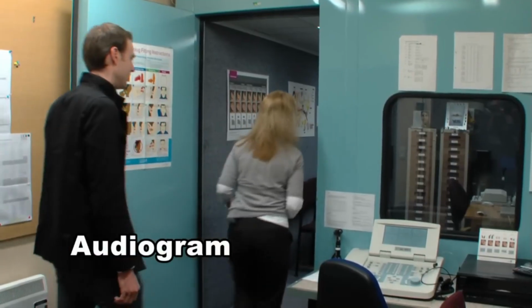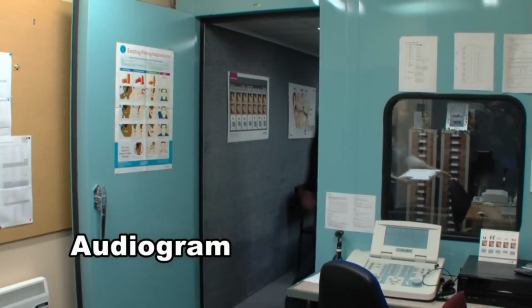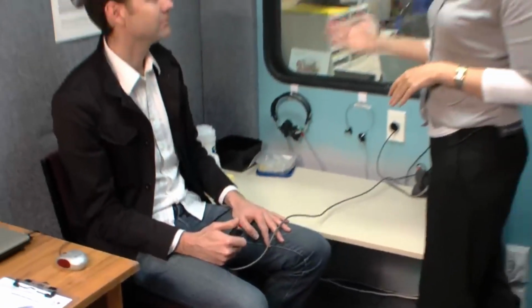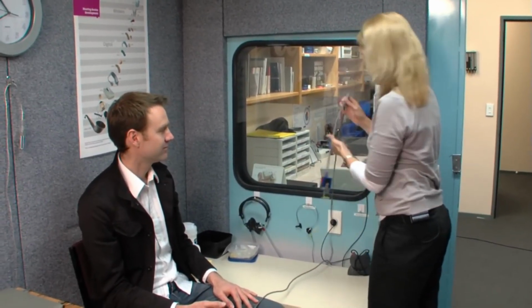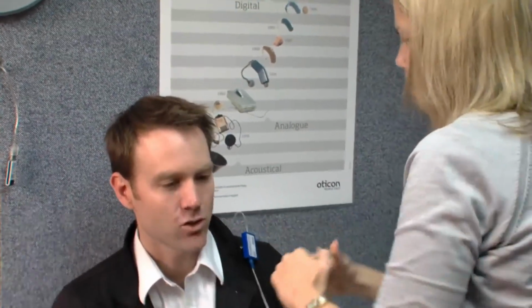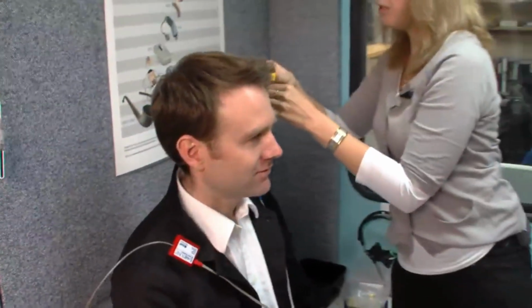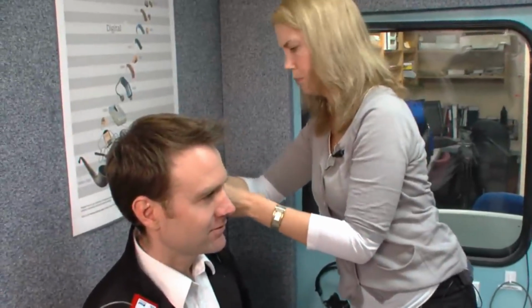Now for the audiogram. Here we go, just have a seat there. I'll just give you that button there. What's going to happen is I'm going to put some headphones in your ears and you'll hear beeps in one ear at a time. Whenever you hear a beep, you're just going to press that red button, even if it's very soft. Okay? I'm just going to put these in your ears. These are right clipped onto your jacket here? Yeah, sure. It just goes in your ear like a foam earplug.